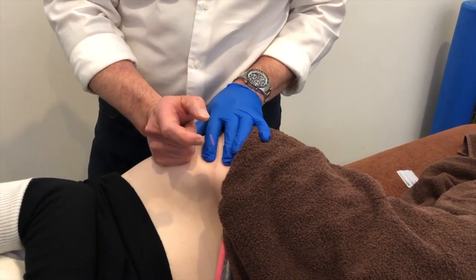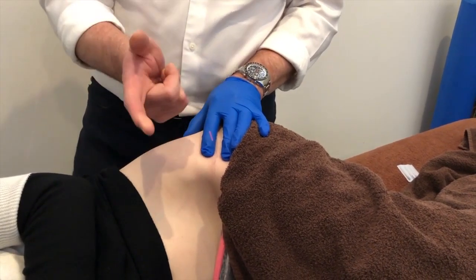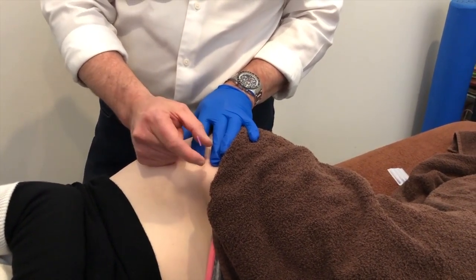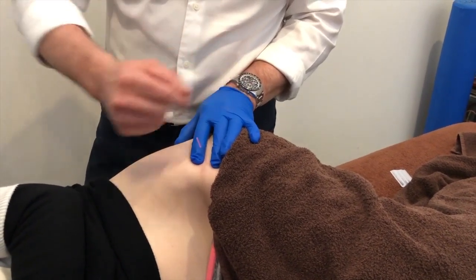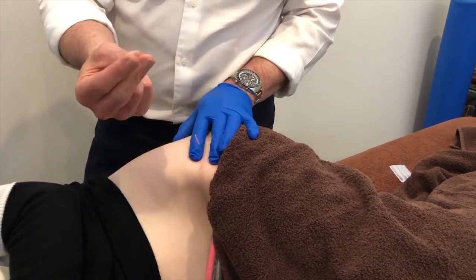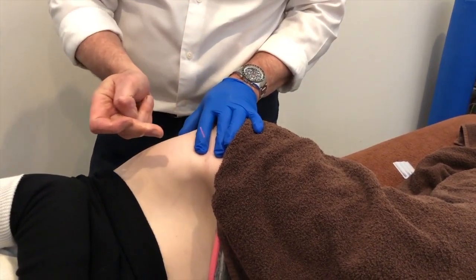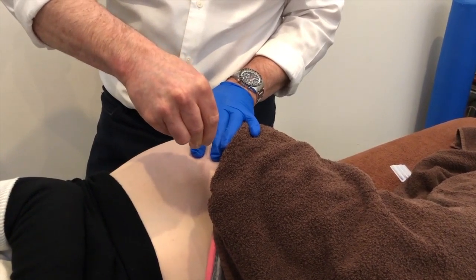Second thing is make sure and also hold down further on the handle, especially with the Huato needles that have got a longer handle, get closer to the tip that way. So the closer you are here to the tip, not on the shaft of course, the more control you have. This one's a really good one. This one here, so we're now in a position where you got those 2 fingers and that thumb holding that shaft and we're going straight down. So now there's not a 90-degree vector across here, it's straight down. So here, as we do that, then we can go straight in.